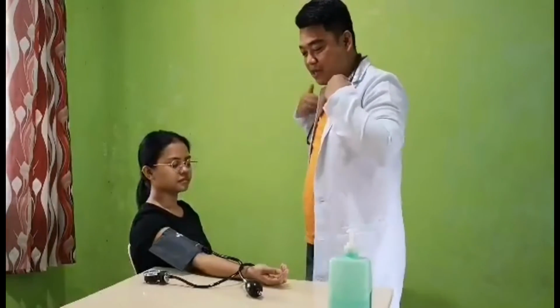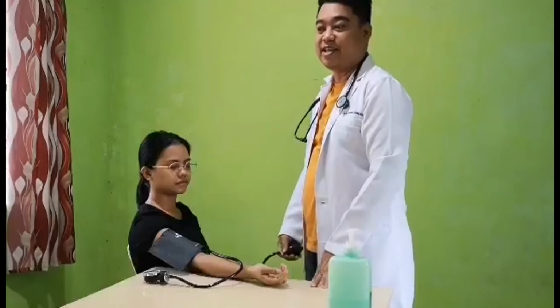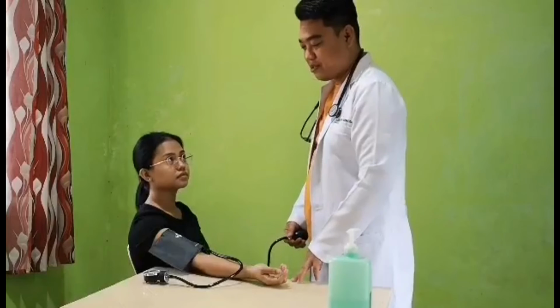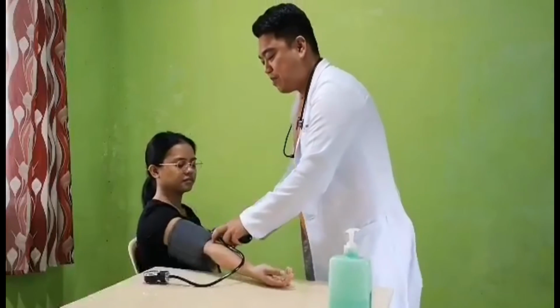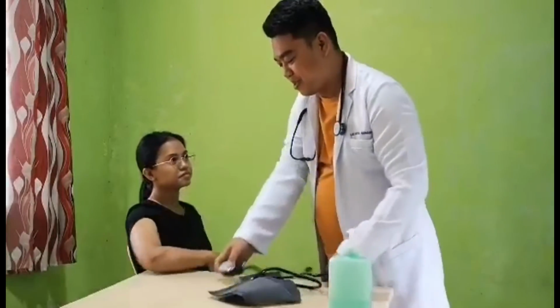After the procedure, I was able to determine that the BP of my patient is 90/60. That is 90 the systolic pressure and 60 the diastolic pressure. Now, I am going to discuss with my patient the findings of her BP, and I will arrange for her next visit. Thank you.